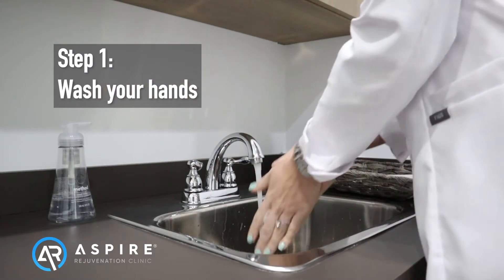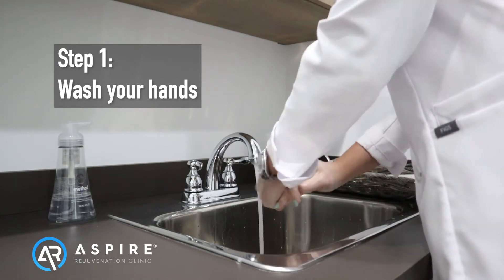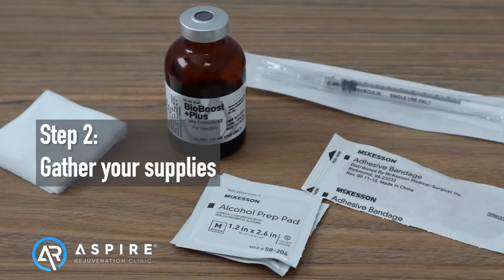First, wash your hands thoroughly. Next, gather all of your supplies. Choose the appropriate needle length for the injection. Grab your medication, of course. Alcohol wipes to clean the injection site, plus a bandage and dressing if needed.